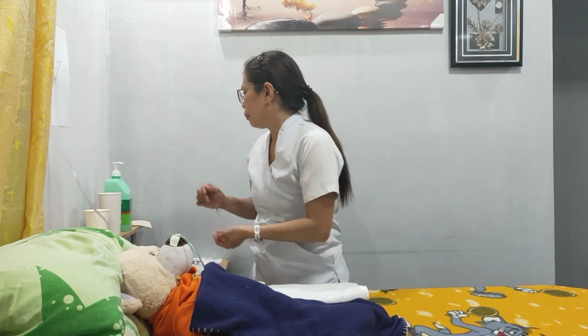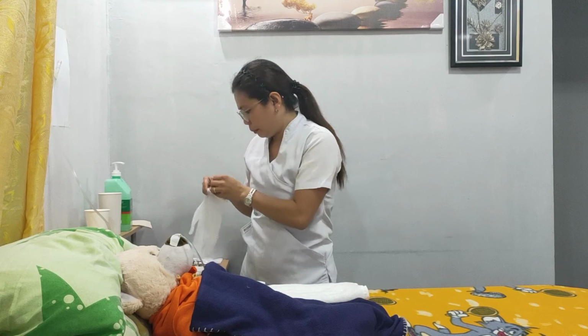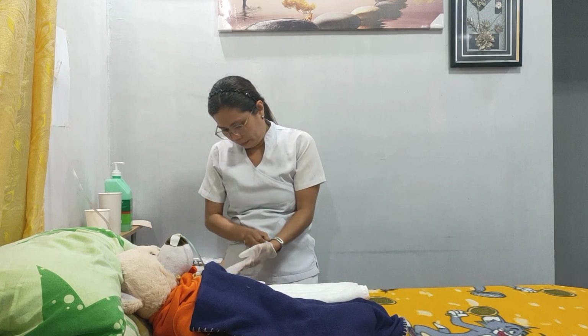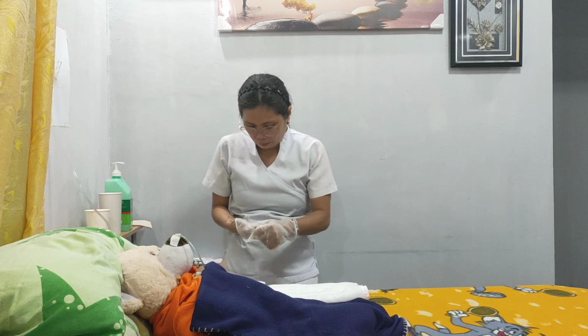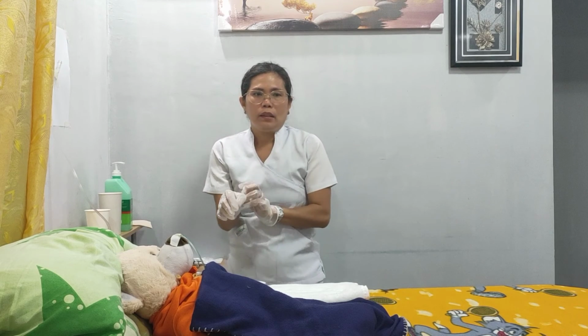Okay. Perform hand hygiene. Put on your gloves. This is to prevent spreading of infections.